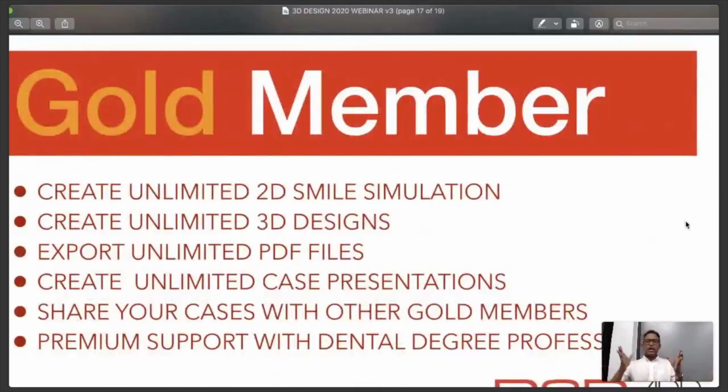So as a gold member, if you are already a gold member, I just want to remind you that you can create unlimited 2D smile designs. You can create unlimited 3D designs. You can export unlimited PDFs. You can create unlimited case presentations. You can share your case with other gold members so you can have a multidisciplinary treatment plan for your patient.